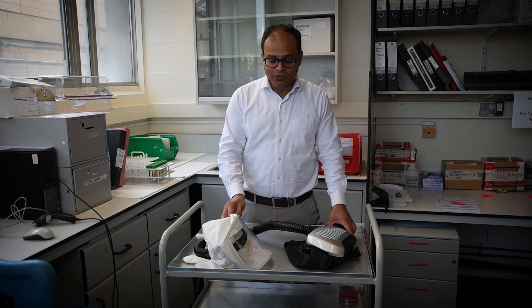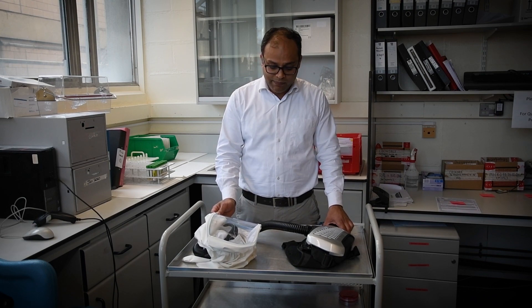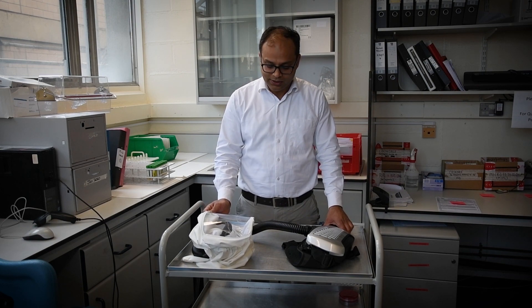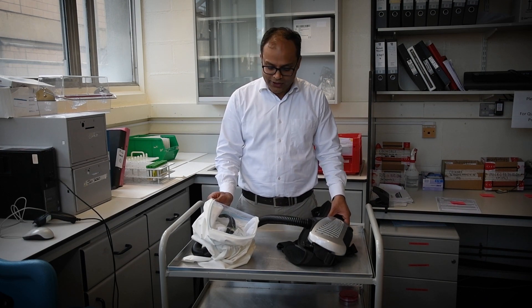My name is Nitin Mahogia and I'm a microbiologist and director of the infection prevention unit at University Hospital Southampton. I'm going to show you our personal respirator. I have to emphasize this is a very important personal protective equipment or PPE, and I'll show you briefly what the components are and how it works.